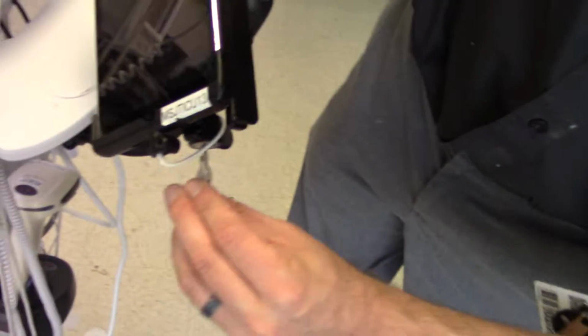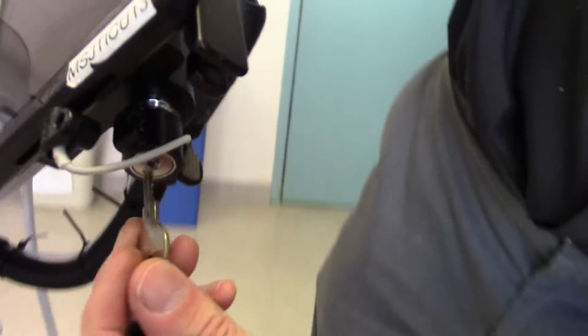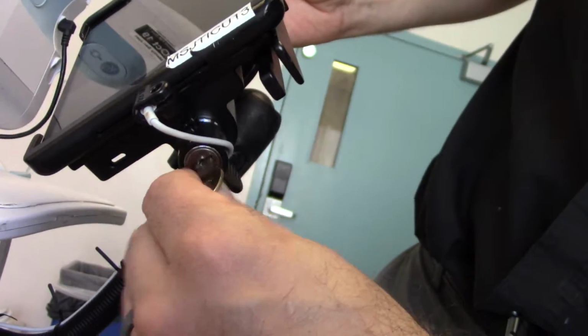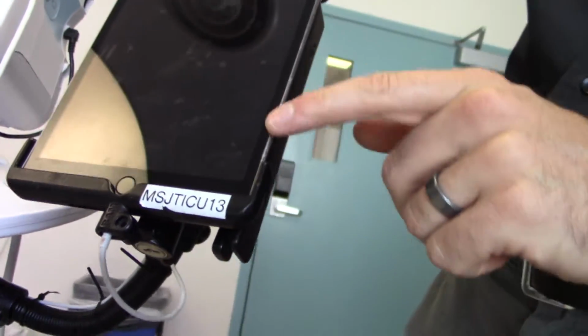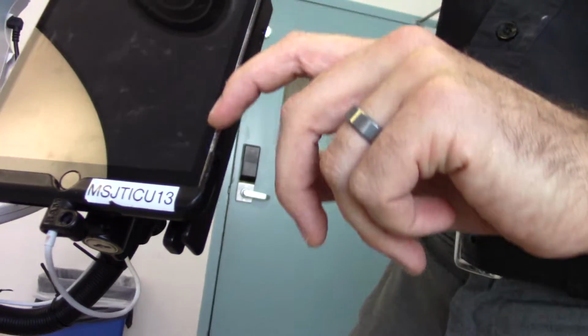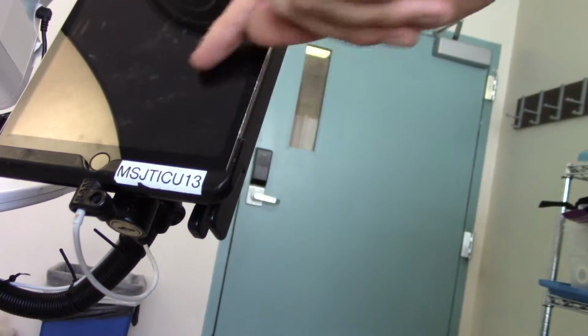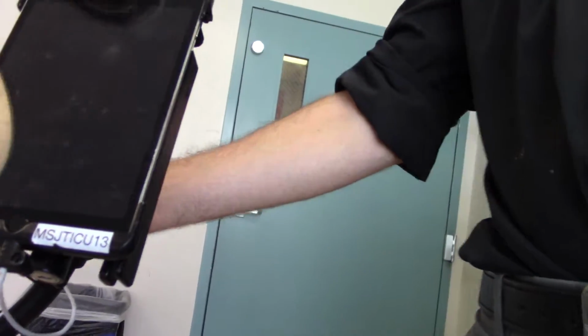These have worked pretty well. The only challenge with these is that, as you can see, the iPad's pretty unprotected from chemical or mechanical damage. And do you get many physically damaged, mechanically damaged? We've had two or three iPads. I mean, they all have some degree of chips on the edge of the screen here. Most of them get an impact on the side here and crack the display. So I think we've had maybe three that have gone down due to that.